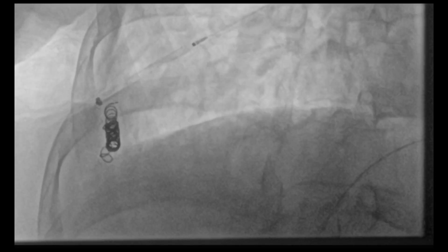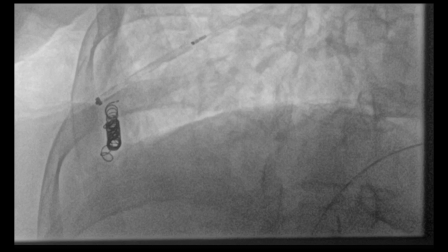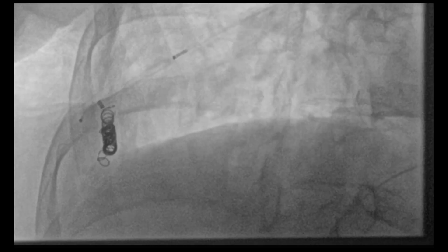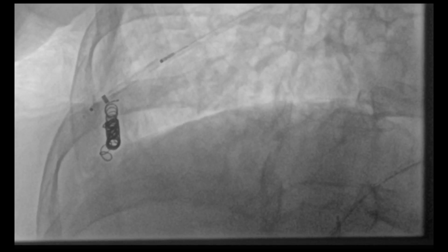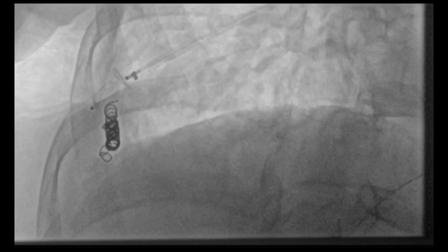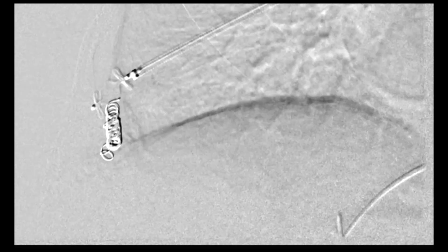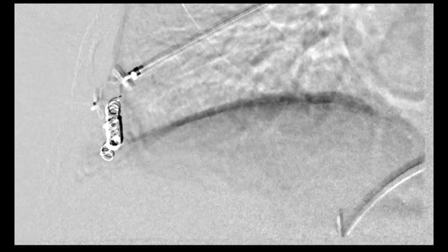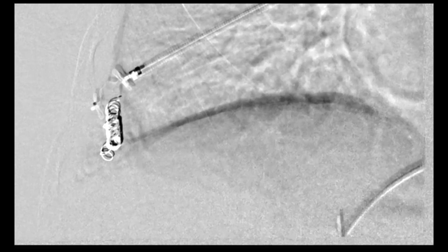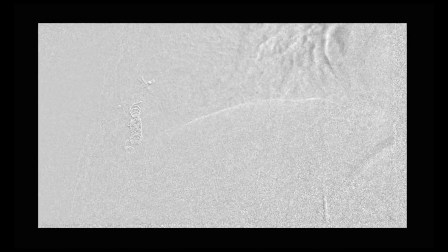The feeding branch roughly measured around 6 mm. We decided to use an 8 mm Amplatzer plug, which was brought through the sheath into this feeding branch of the pulmonary AVM. The sheath was retracted back and the implant plug was then deployed into this larger branch. A repeat angiogram was then performed with the plug in place. A completion angiogram was then performed showing successful exclusion of this pulmonary arteriovenous malformation.